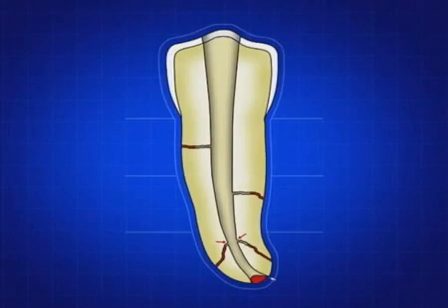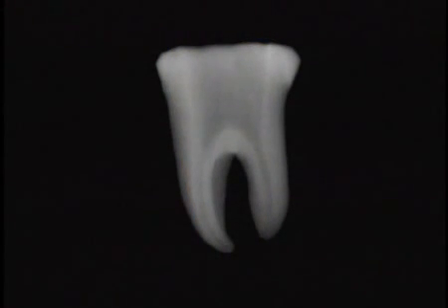Recall that a Type 2 transportation represents a moderate movement of the physiologic foramen to a new iatrogenic location. As such, the apical 1/3 of the canal exhibits more reversed apical architecture than a type 1 transportation. In treating these cases, a barrier can be selected to control exudates and provide a backstop to pack against during subsequent obturation procedures. Here we're going to see the development of a type 2 transportation.